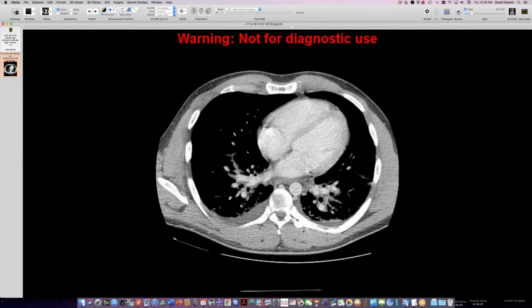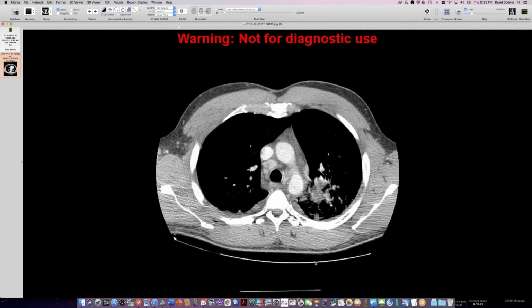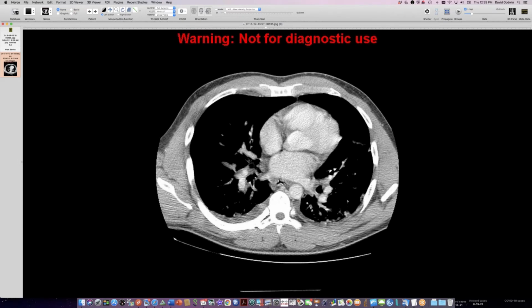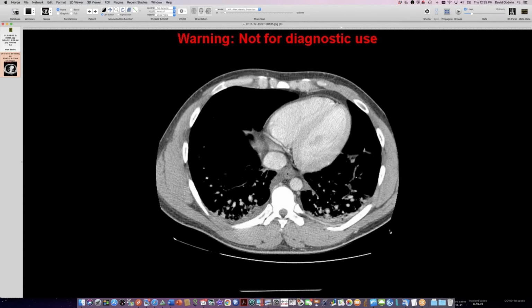So this is tularemia. It's a fairly compact pneumonia, and there's quite a bit of lymphadenopathy. And in this case, not only that, but also pleural effusion and some lung edema. So tularemia, and there was a history of some contact with animals. I'll clarify that history by the time I post this case. So that's a case of tularemia. I showed a couple of cases of tularemia a couple of weeks ago.